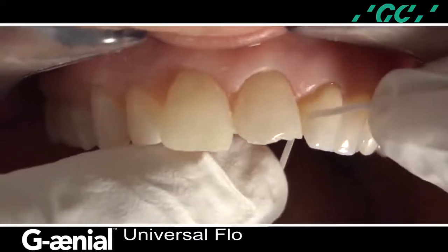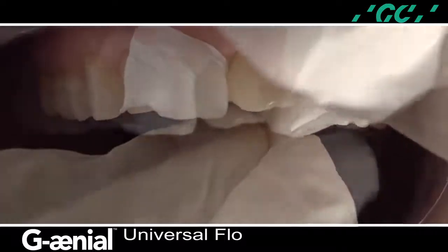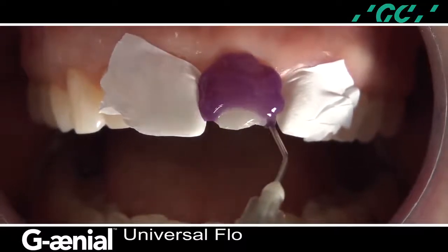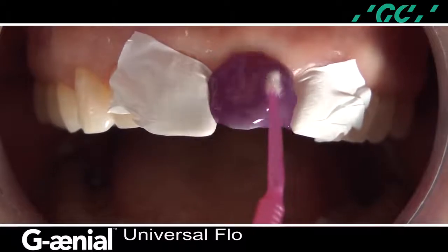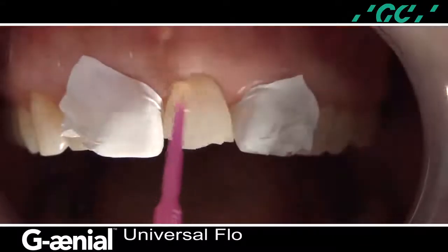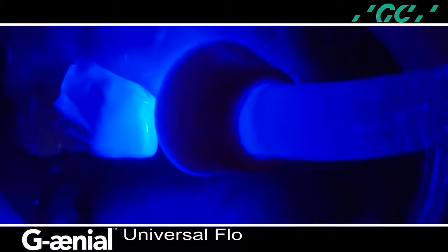The same procedure is accomplished on the maxillary left central incisor. The maxillary left central incisor is separated by applying Teflon tape or a small amount of glycerin onto the completed composite transitional restoration and the adjacent lateral incisor. The entire incisal facial enamel surface is etched using a 37.5% phosphoric acid semi-gel etchant by Kerr, agitated with an applicator tip for 10 seconds, rinsed for 5 seconds, and air-dried for 5 seconds using a warm-air tooth dryer. A light-cured adhesive, Genial Bond, was applied to the unprepared surfaces with an applicator tip, allowed to dwell for 10 seconds, air-thinned using a warm-air tooth dryer, and light-cured for 20 seconds.